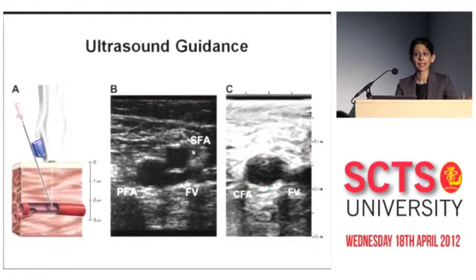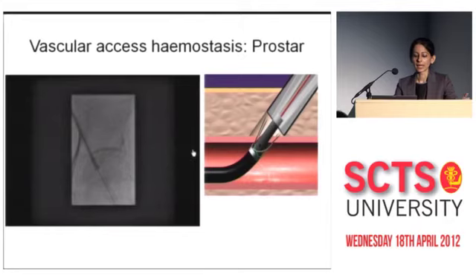Ultrasound guidance can be very helpful, and if CT pre-procedurally has identified that there is a segment of disease or calcification to avoid, then we do use this to improve our precision and accuracy when making femoral puncture. And then, having gained access, we obviously have to pay attention to how we're going to close our access site at the end of the procedure.